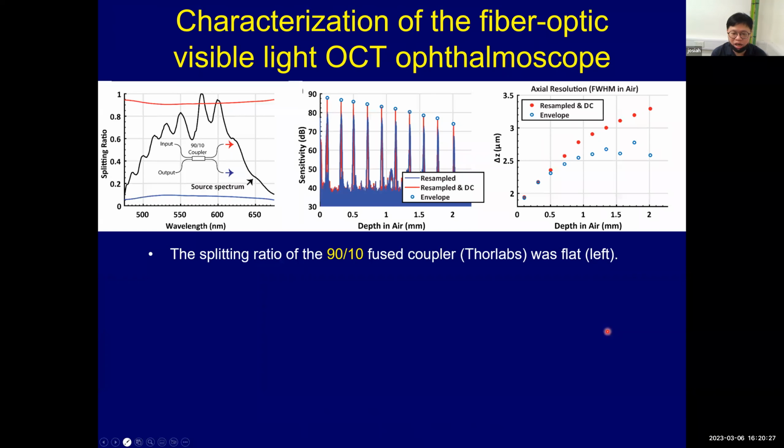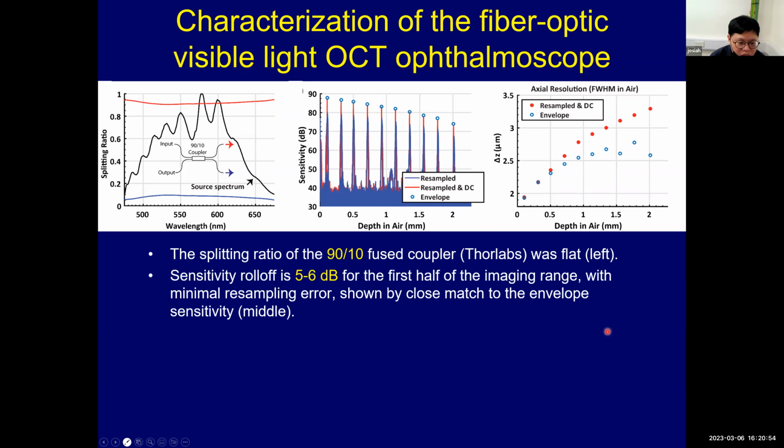A lot of things are harder in visible light than in the NIR wavelength: the loss is higher, the operation bandwidth is shorter, and the aberration is more severe. Everything gets more difficult because fiber technology was optimized for near infrared light earlier than for visible light.